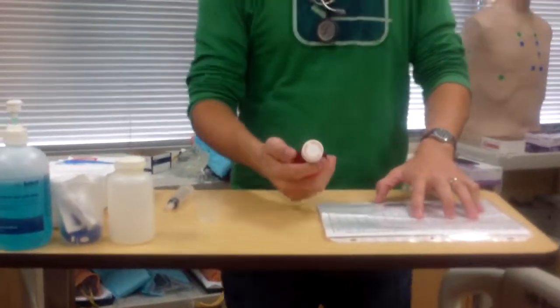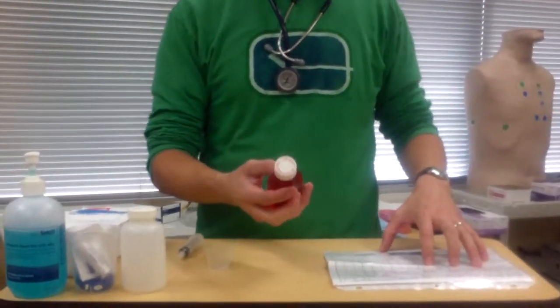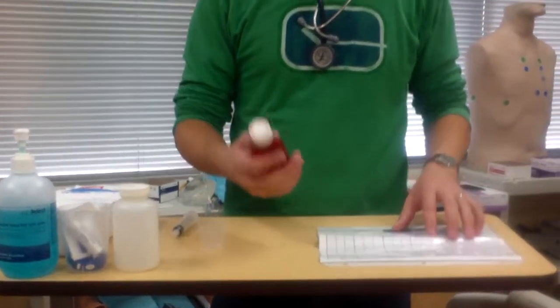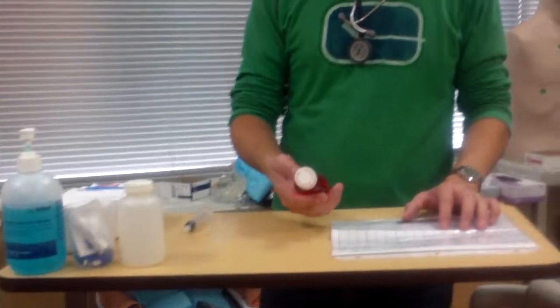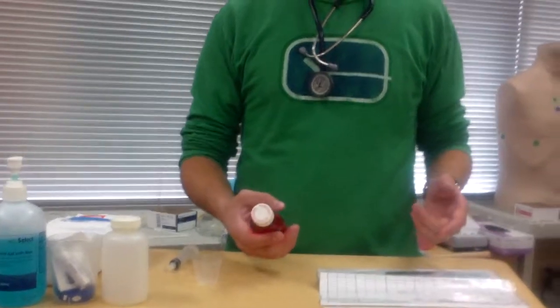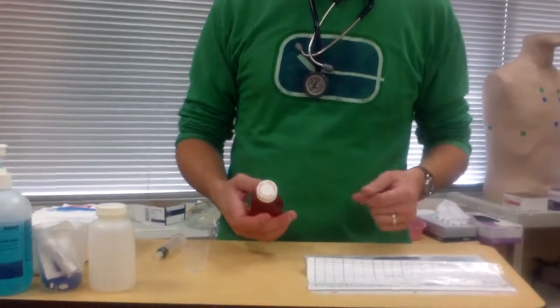So I'm going to pull that Tylenol liquid form out of my stock supply, and I know that this is the right one. This is the first check, Tylenol, and they're only giving 1 medication. So then the second part is doing the second check. So I know that I have the right medication, the right patient, time, route, dose, and time. So that's good. And I know that I did my drug calculations, and I know the effectiveness of the drug, the adverse reaction of the drugs, the purpose of the drug, and any nursing considerations that I need to do for this drug. So that all checks out.